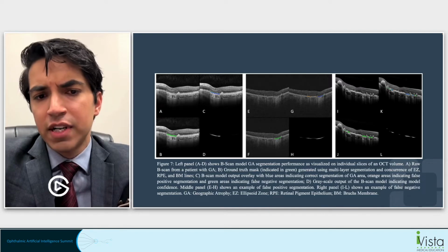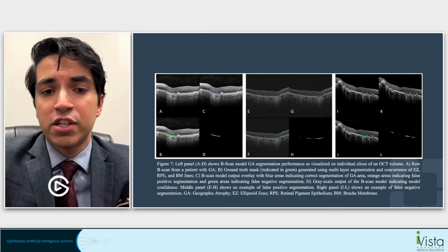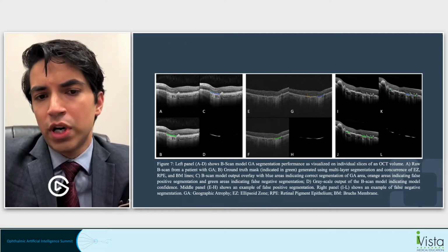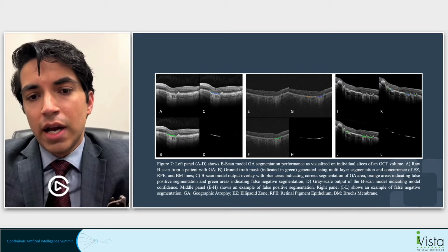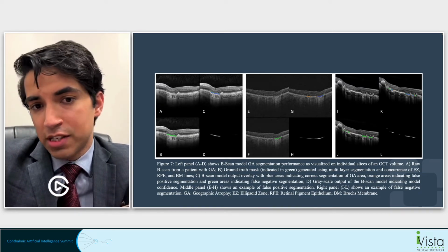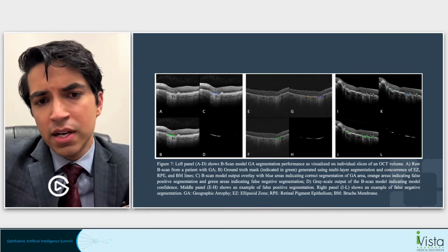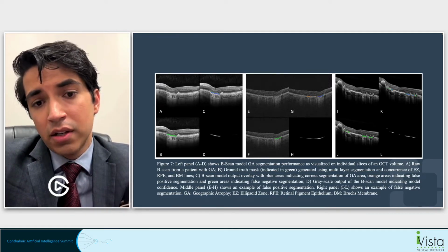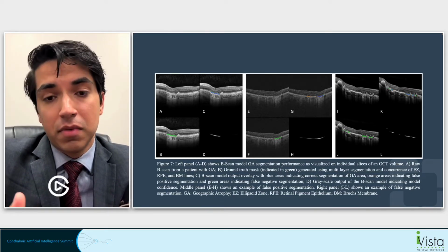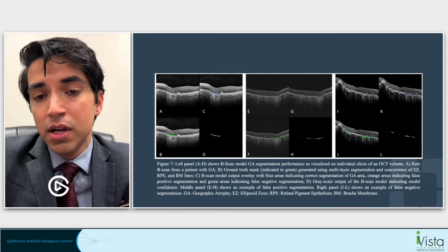And the confidence map, or the deep learning grayscale output, reflects that the areas which are very bright are where the model was very confident that GA should be marked. The last panel on the right shows an example with pretty high pathology. There are some RPE deflections that appear to interfere with how the model would comprehend this image, but it seems to still hold up pretty well.